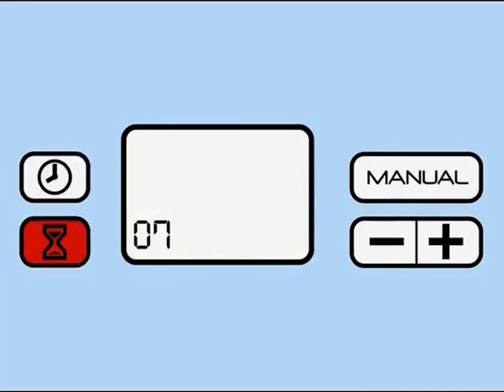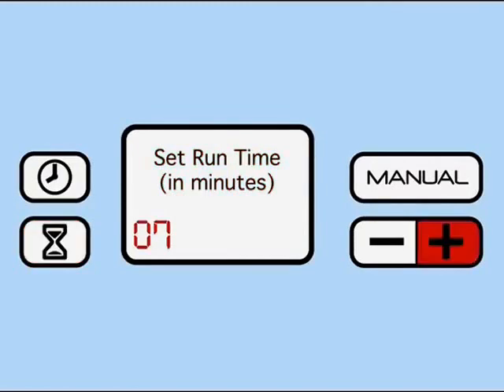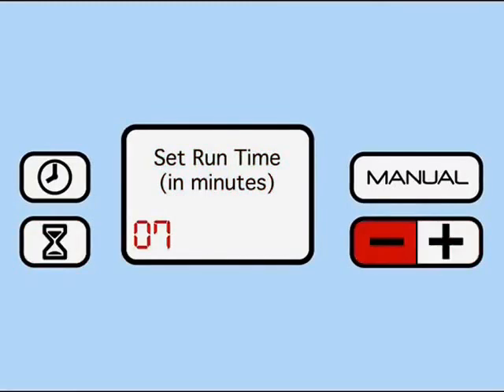You'll then be prompted to set the run time, that is, how many minutes the soak clean operates during its daily cycle. Increase or decrease these minutes by pushing the plus or minus buttons. 5 to 10 minutes should be enough to completely sanitize your equipment.